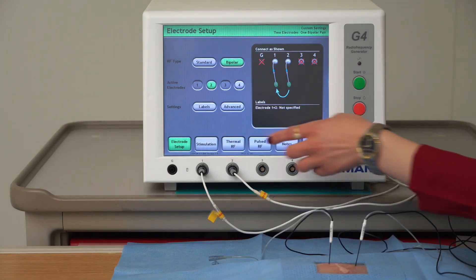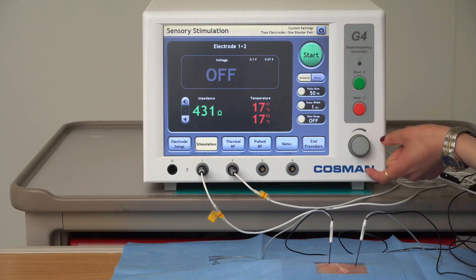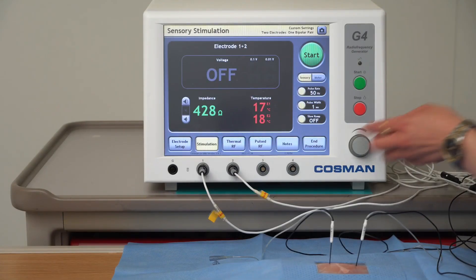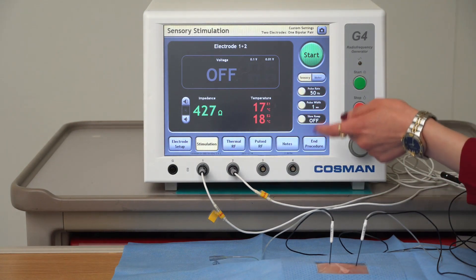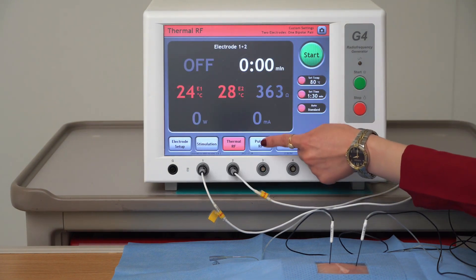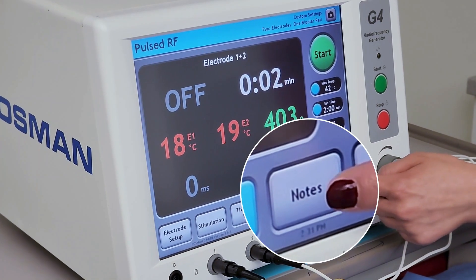It offers numerous customization options, including sensory and motor stimulation using the knob or the touchscreen. Simultaneous start of radio frequency output with enough power to heat four cannulas at the same time. Also, the widest range of thermal and pulsed RF settings are available. In the notes, all procedure readings are automatically stored.